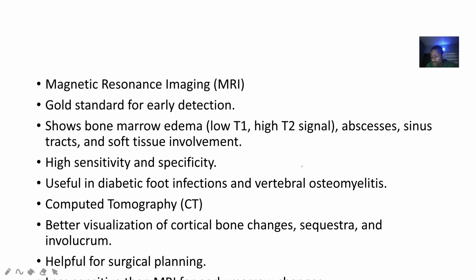We also have magnetic resonance imaging, that's MRI. MRI is actually the gold standard, even for early disease that is just starting. It shows fluid accumulating in the bone, shows abscesses, sinus tracts, and soft tissue involvement. It also has high sensitivity and specificity. It's useful in diabetic foot infections and also vertebral osteomyelitis.